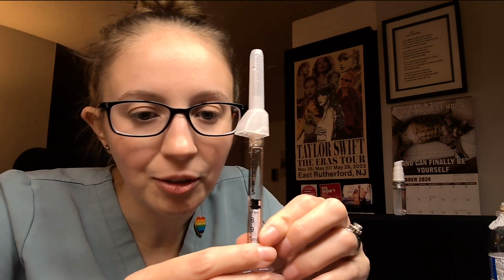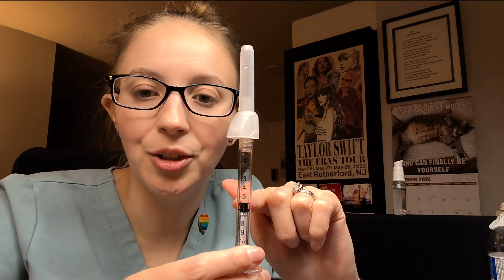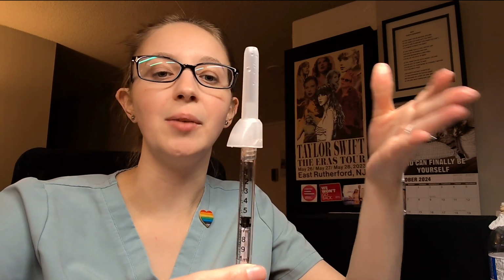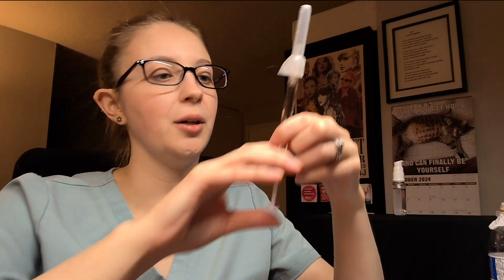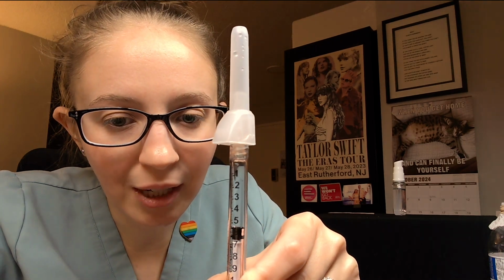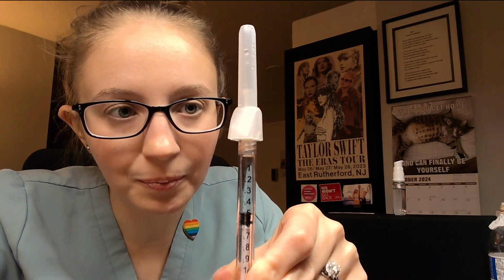Last thing to check once you're done with the air bubbles is make sure, is the medication at the correct dose? Because sometimes you might have drawn up too much extra. Sometimes you might have pushed out too much when you push the air out. So in our case, I did draw up too much. So we're going to scooch our plunger back up to 5. Like that. Good. Now your medication's ready to go.